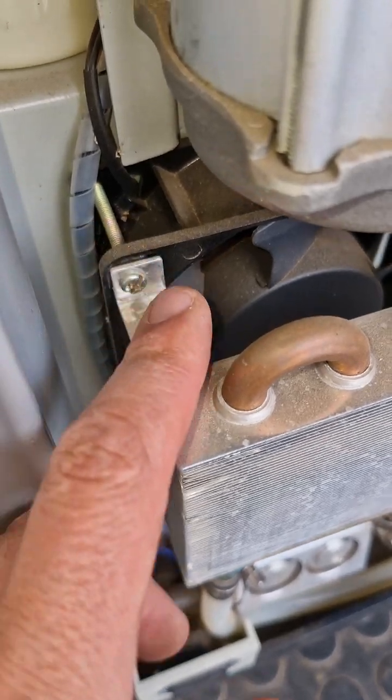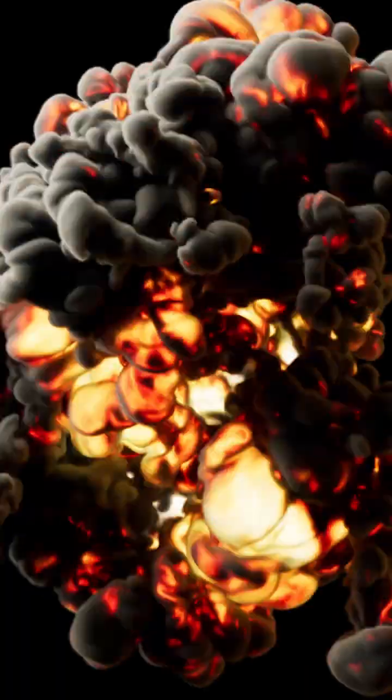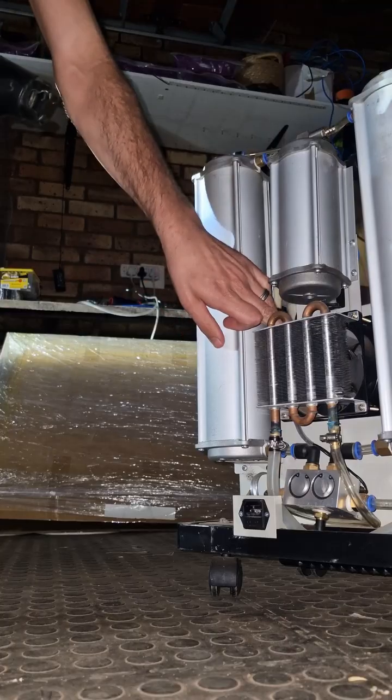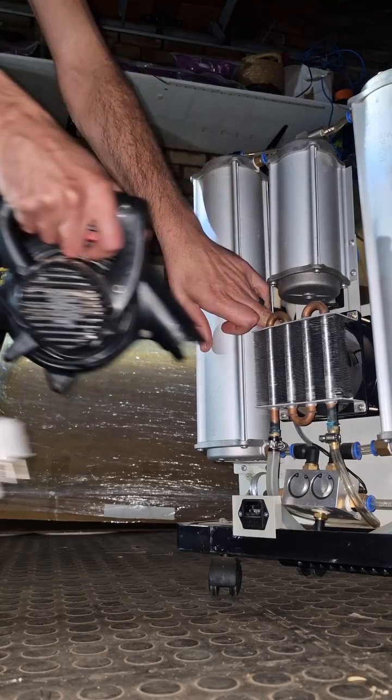Now we get to use the blower. When using your blower, look out for your fans. You need to hold your fan still. If you cause the fan to spin, it can generate electricity, and this can cause an explosion. Well, a small explosion. Just don't do it. Hold your fan still while blowing dust away.